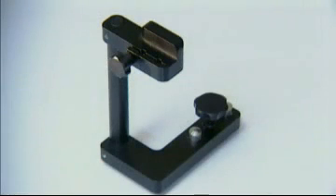The registration joint holder can be used as an alternative. In this way, the UTS does not have to be transported to the dental laboratory. Try-in.